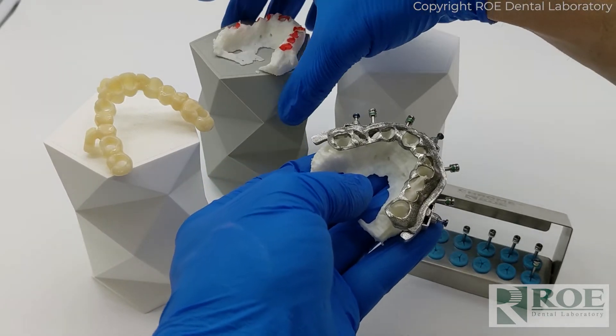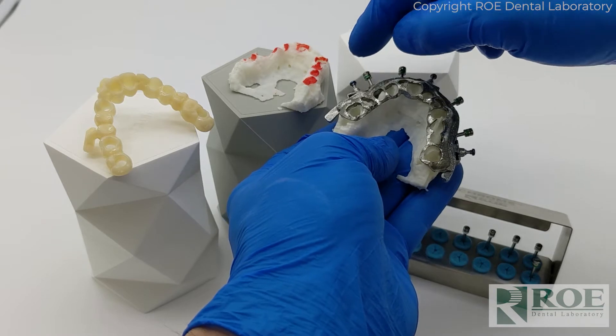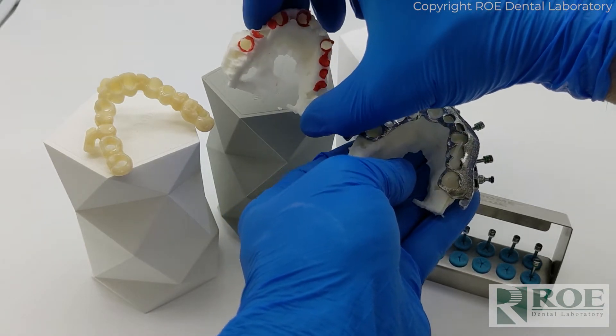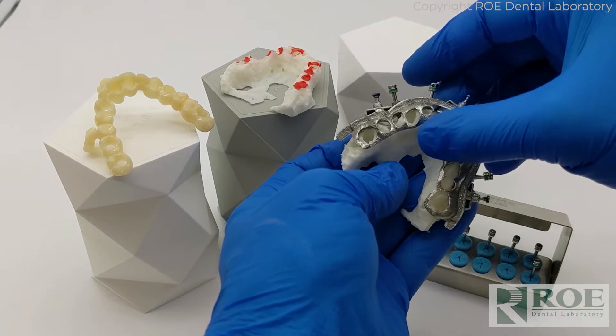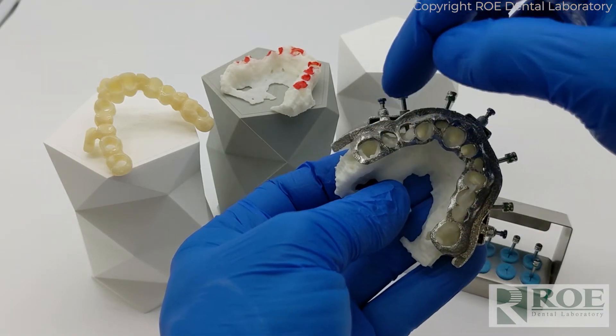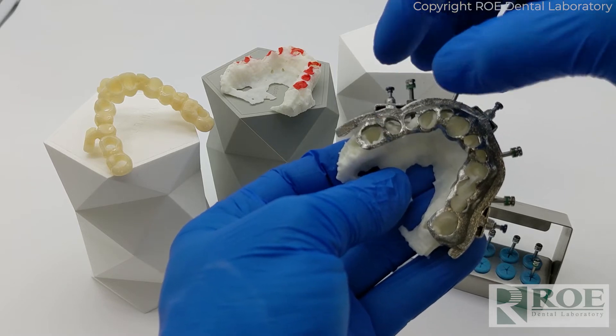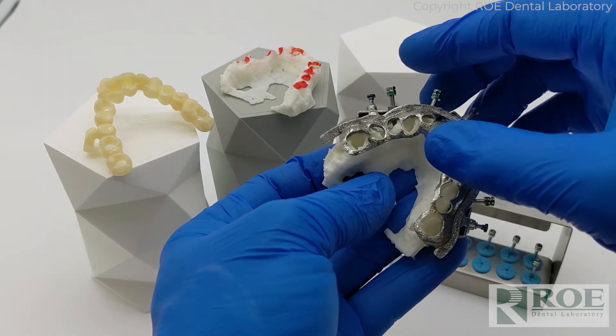In this site here we opened up the socket a little bit in red. Here on this site, as you can see right inside of this site here, maybe number three or four, there's just some bone there in the way that will affect the pontic design of the restoration.